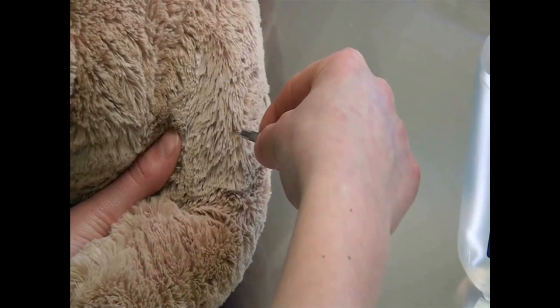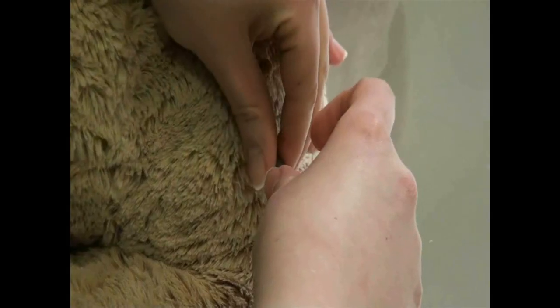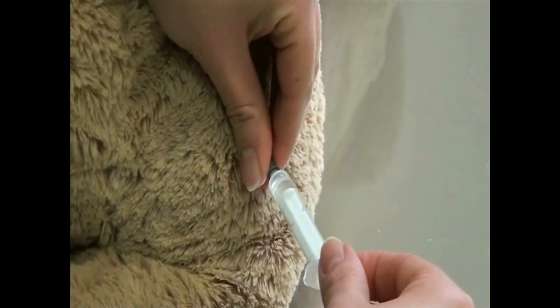Insert the needle perpendicular to the skin in the caudal thigh muscles. Aspirate to ensure you have not penetrated a blood vessel.